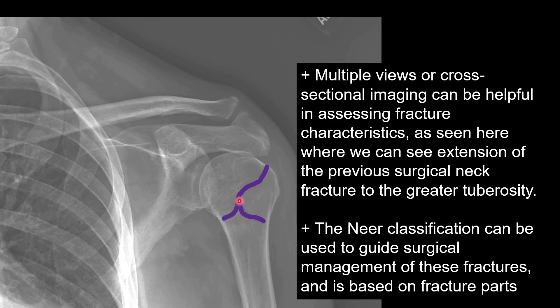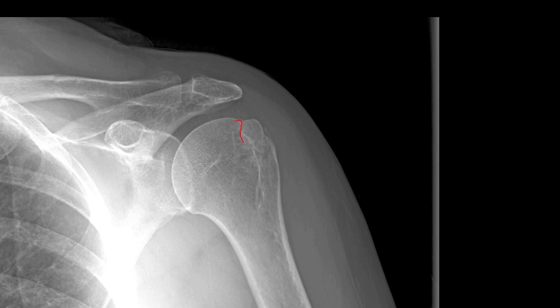Multiple views and cross-sectional imaging can be helpful in the classification of these fractures. One system we can use is the Neer classification system, which guides surgical management. This system is based not on fracture lines but on fracture parts — a part is considered separate if it has at least one centimeter of displacement or 45 degrees of angulation. A minimally displaced fracture like this would be a one-part fracture. That greater tubercle fracture we saw earlier would also be one-part, but if displaced more than one centimeter, it would be a two-part fracture.